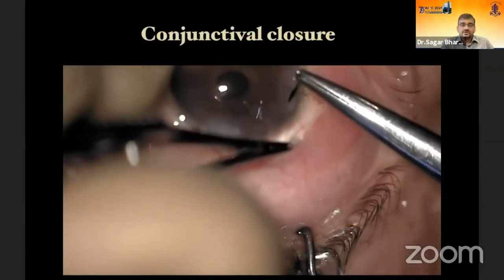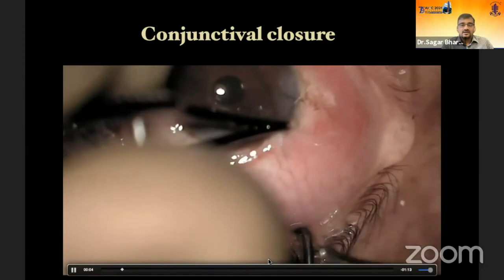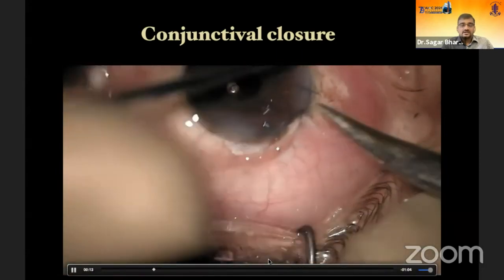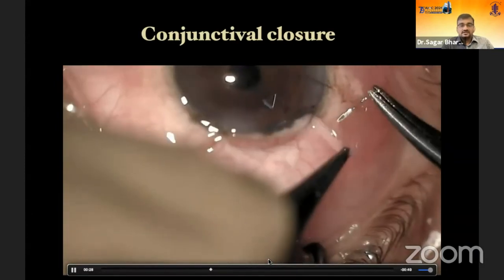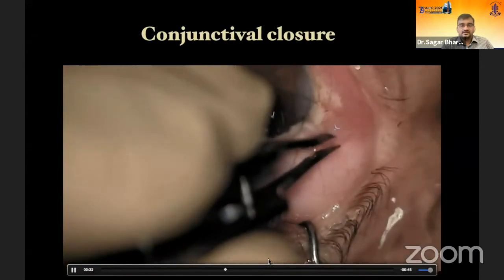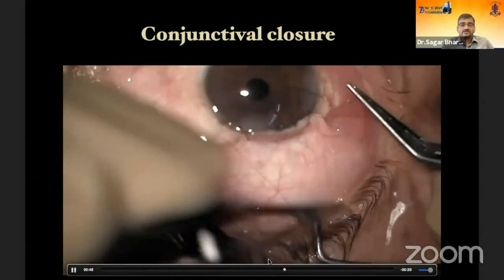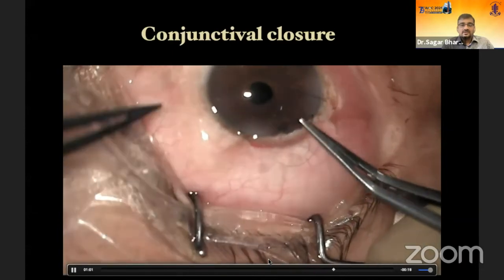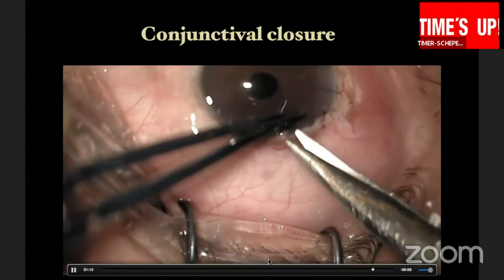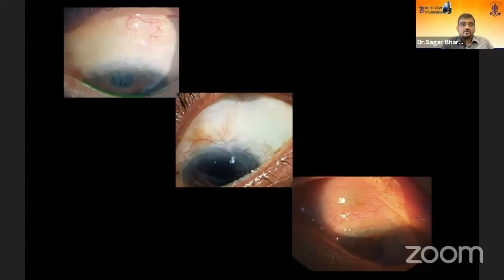For conjunctival closure, put a box suture and close it out. Closure is very important — you don't want any leaks in the post-operative period. A mattress suture is taken on one of the radial incisions to ensure complete closure. You can also take one central box suture anchoring the conjunctiva to the cornea in the middle, ensuring the flap doesn't recede back. With a standardized technique, you tend to get more posterior blebs that are quite diffuse.